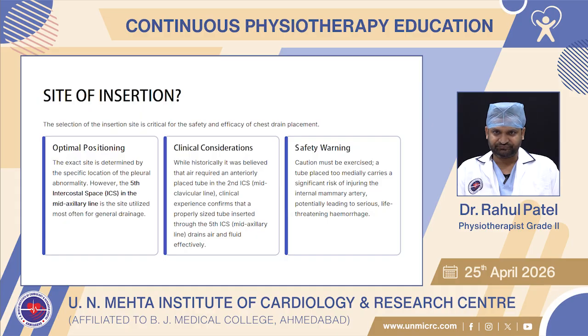Safety warning: caution must be exercised. A tube placed too medially carries a significant risk of injuring the internal mammary artery, potentially leading to serious life-threatening hemorrhage.